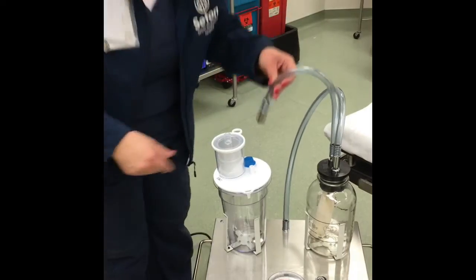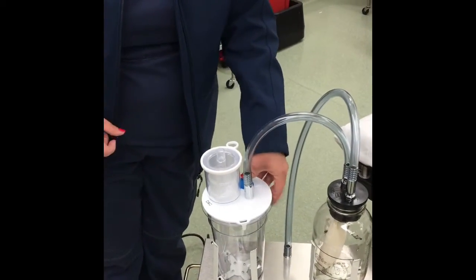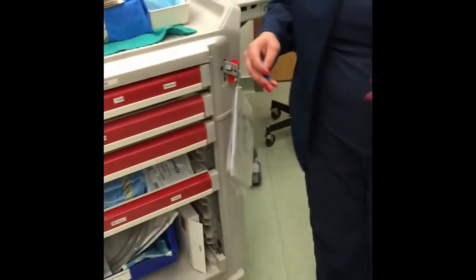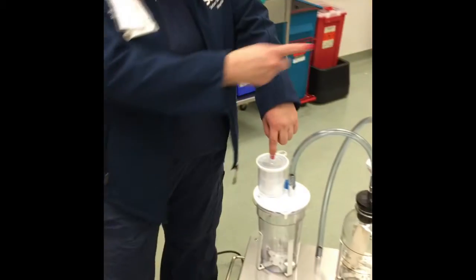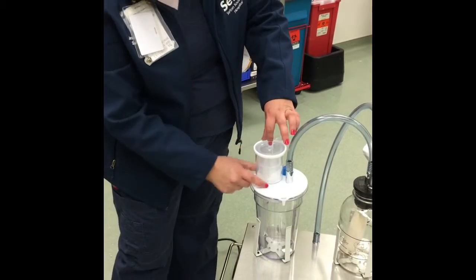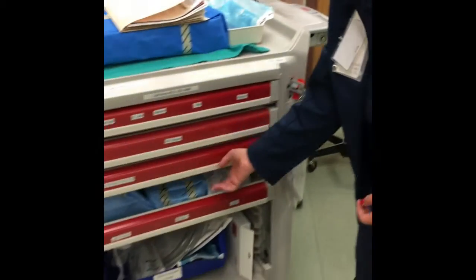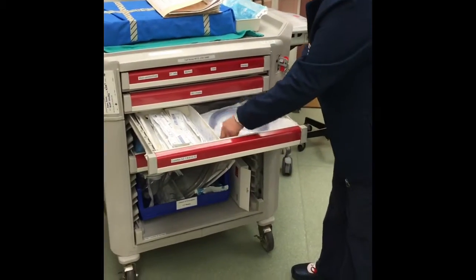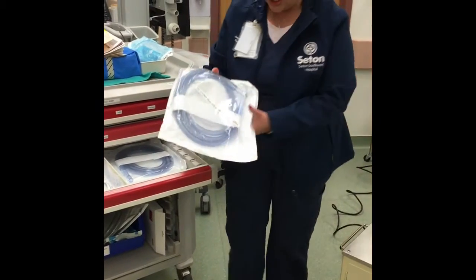And how it connects to this machine is there's one port here, and it just goes right in there. The portion that's gonna come from the field that you're gonna plug in is gonna go into this part, so that anything you collect comes through here into this filter and then goes into this container. So this is the tubing that the scrub tech will have on their field.